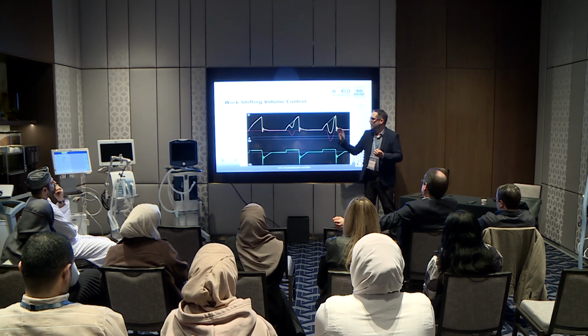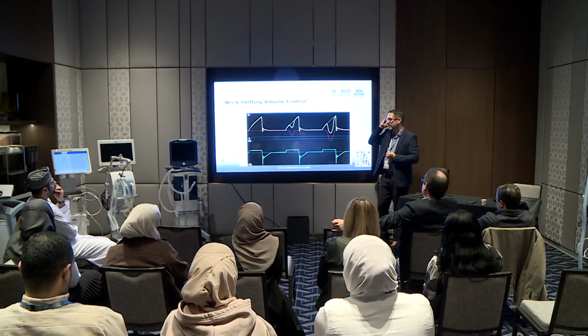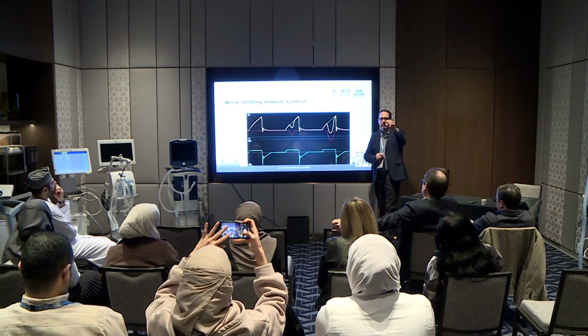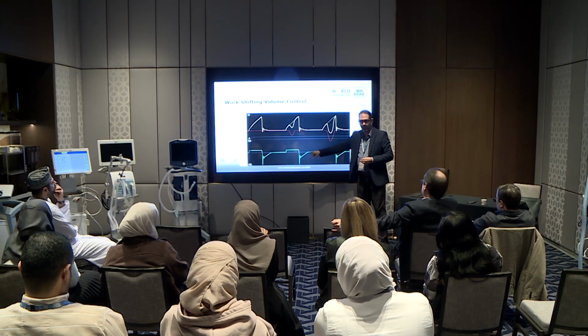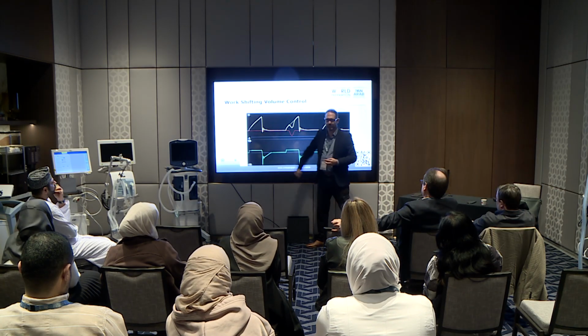Now, work shifting is a word that's used in this paper, but essentially what I call this is just the level of assistance. So work shifting means work is being shifted to the patient. And how do you know that? Well, in volume assist control, where you're fixing the flow, if the patient is not breathing, there's going to be no impact on the pressure.